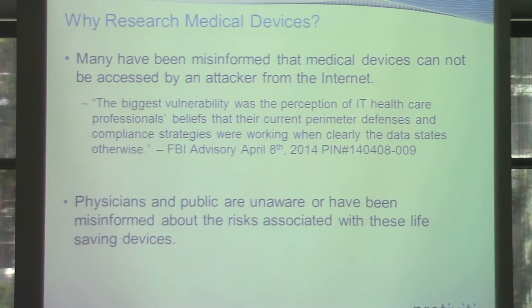But with that, I got a lot of pushback, even from physicians, to that research. They said, yes, you found some of these issues inside of devices, but there's no way, I put my PhD title on the line, that you can get these things from the internet. They're all internal, they're segmented. Well, I worked in healthcare, and I knew that wasn't the case. Things are changing in healthcare, and there's a need to push all that data back and forth between these devices and the medical record. Things like population management and real-time vital information are very important to get. In doing that, I knew you couldn't segment these, and I also knew that critical infrastructure in medical devices is often recommended to be opened up through the firewall for remote support for manufacturers. So that's another reason I did it.